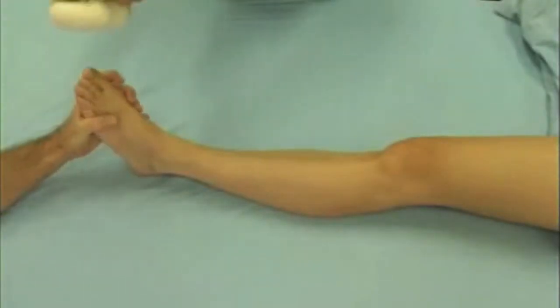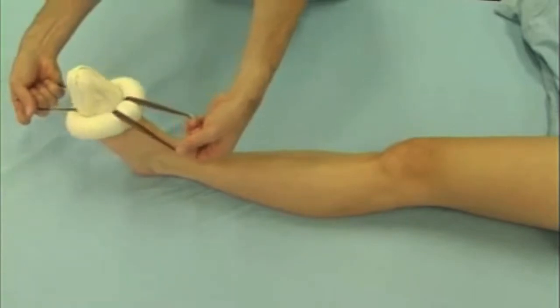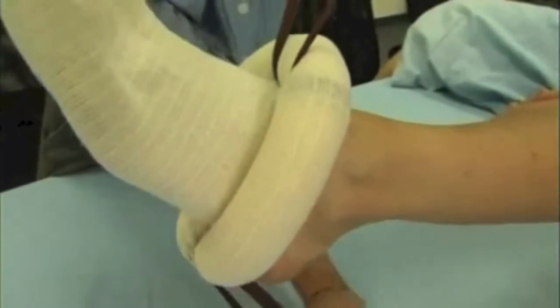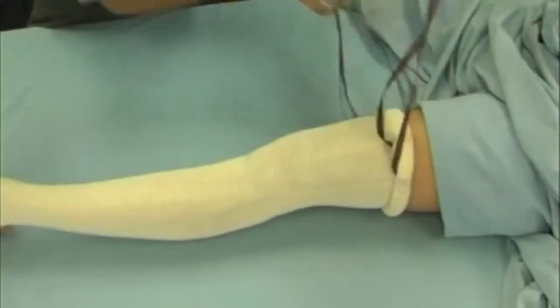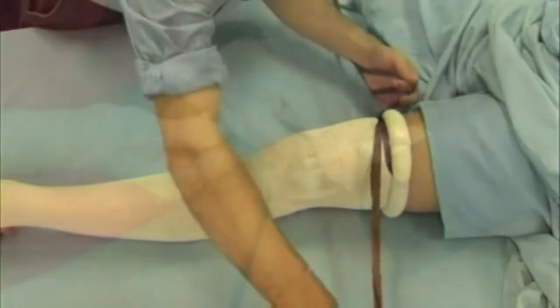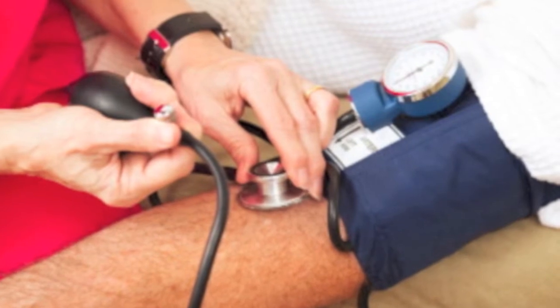How to apply the EED. Remove the patient's shoes. Place the EED over toes with handles away from patient, one handle facing the top and the other handle facing the bottom of the foot. Use bottom-facing handle to get the EED over the heel. Pull handles towards the patient and roll the EED to mid or upper thigh. Secure EED in place by twisting straps around the leg. Assess patient. If needed, apply second EED to the other leg.